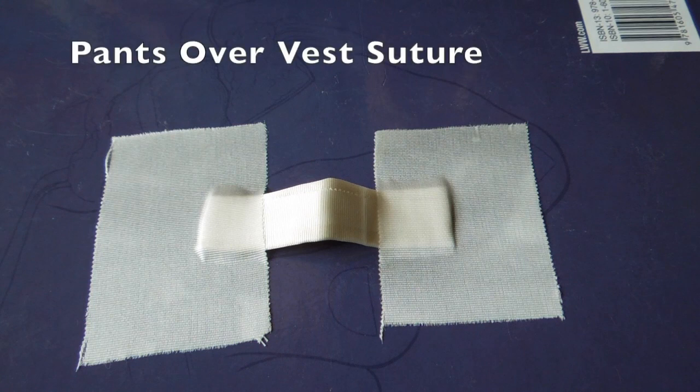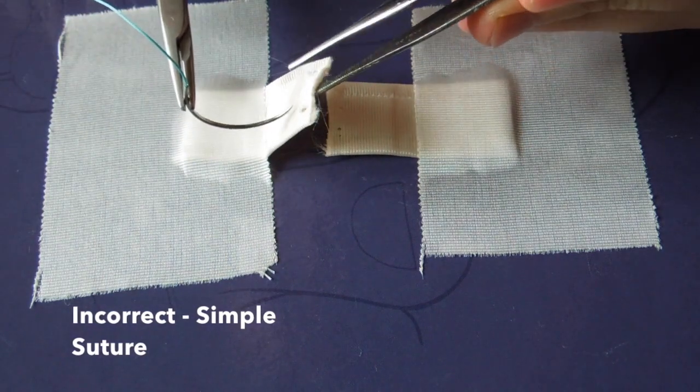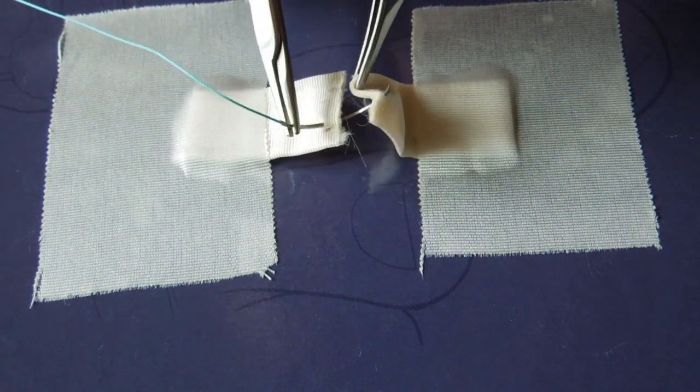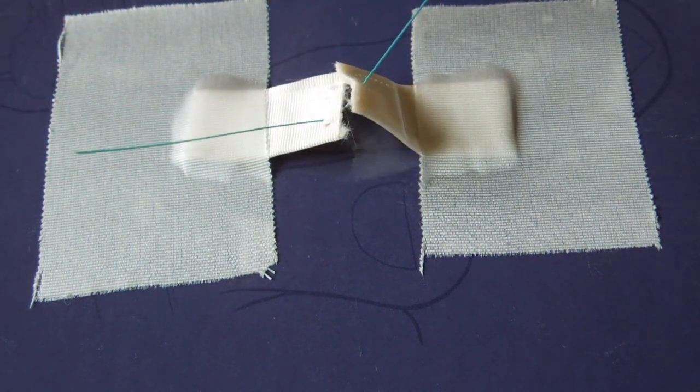This is a tutorial for a pants over vest suture. First, to emphasize why we do a pants over vest, here we're going to take two sides of a tissue and attempt to re-approximate them with a simple suture.